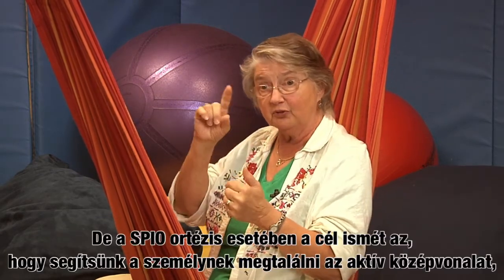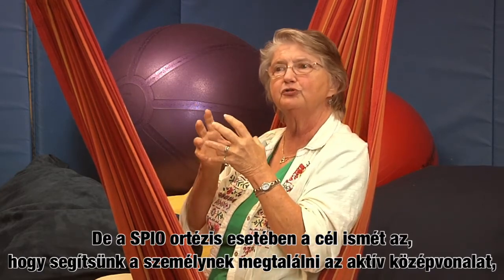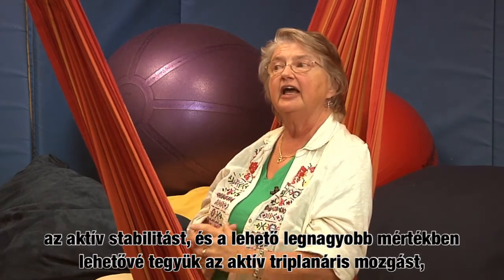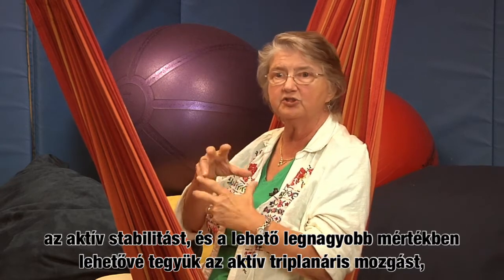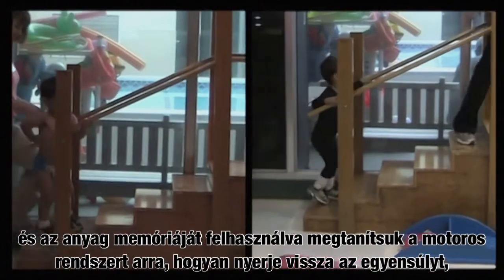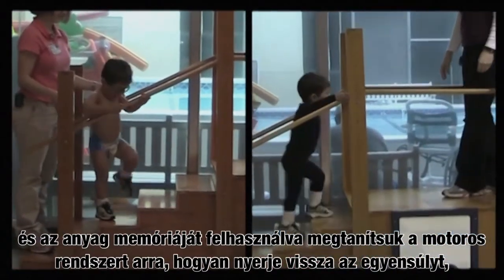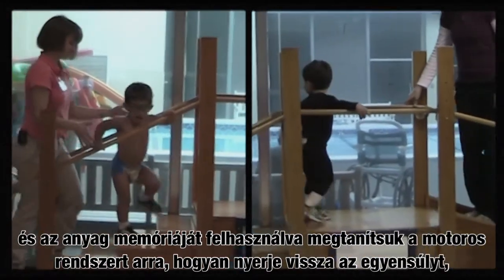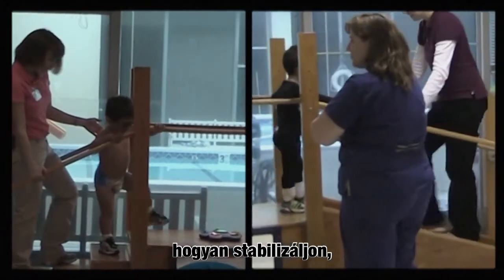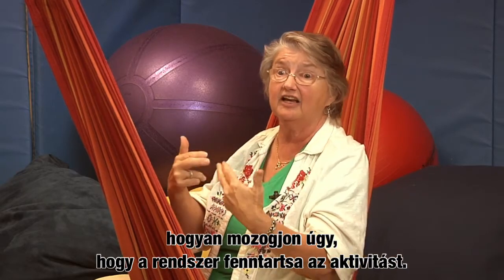But for Spio orthosis, the objective again is to help the person to find active midline, active stability, and to permit as much as possible active triplanar motion, and to use the memory of that material to teach the motor system how to recover balance, how to stabilize, how to move in such a way that the system maintains activity.